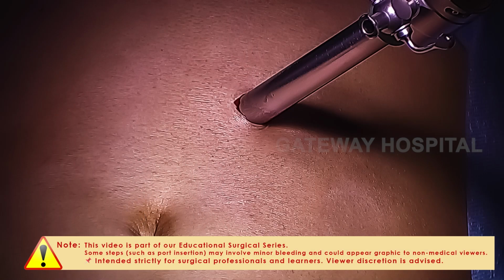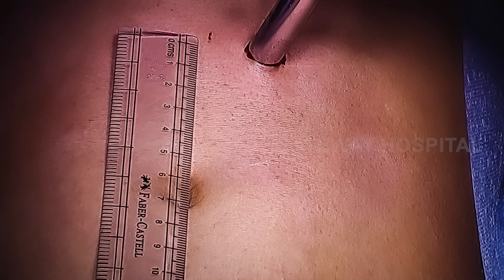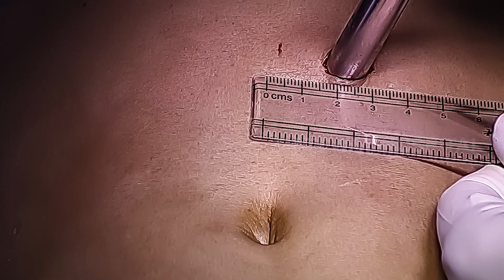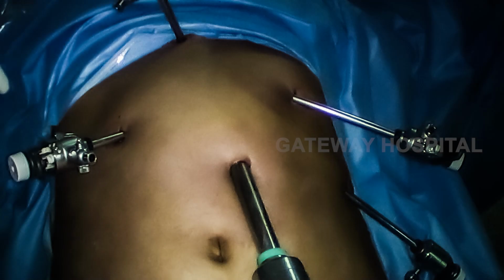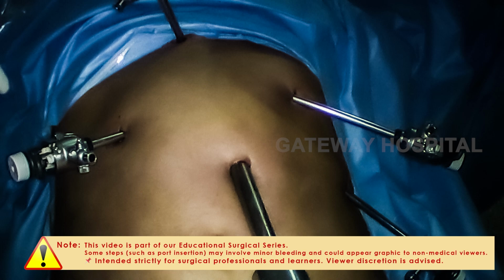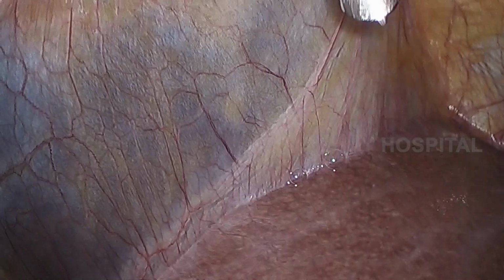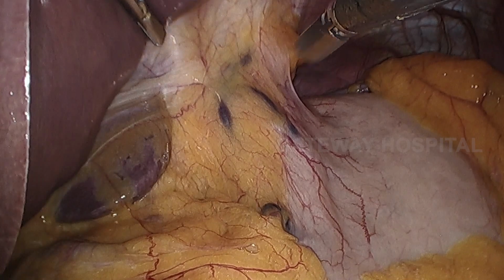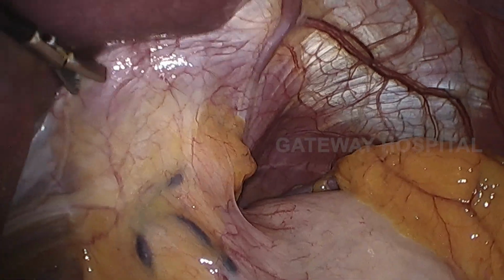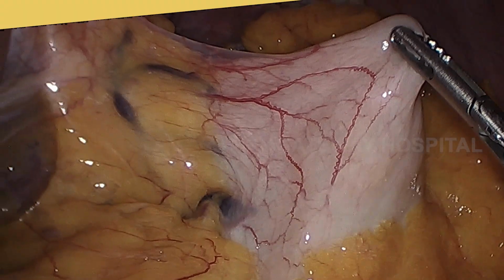We use 5 ports. The camera is about 5 cm above and onto the left of the umbilicus. 2 working ports, 5 mm, and another 5 mm subxiphoid port is used to retract the left lobe of liver. We lift the left lobe of liver anteriorly and grasp the diaphragm by using a tooth grasper so that it will remain in place till the end of the procedure.